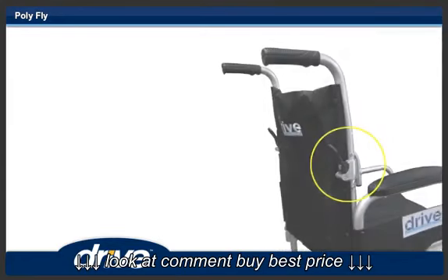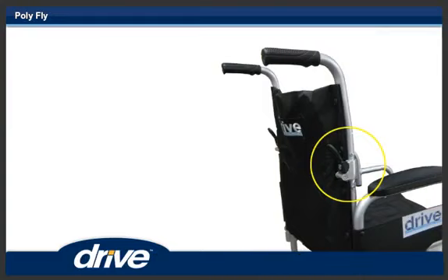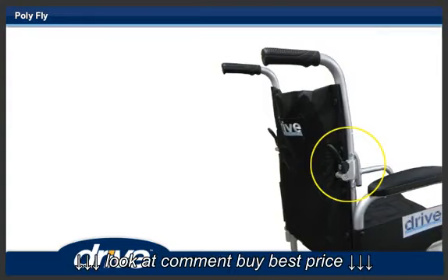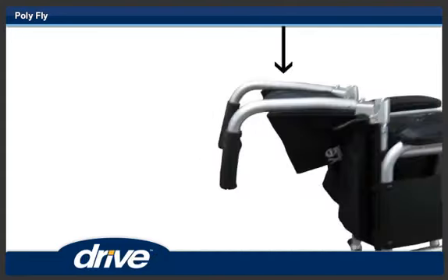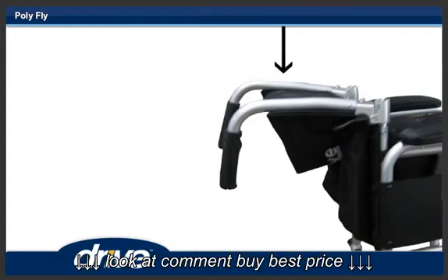To unfold the back, lift up on both push handles until the back locks into place. Step 19. To fold down the back, push in both back locking levers and let the back fall down.